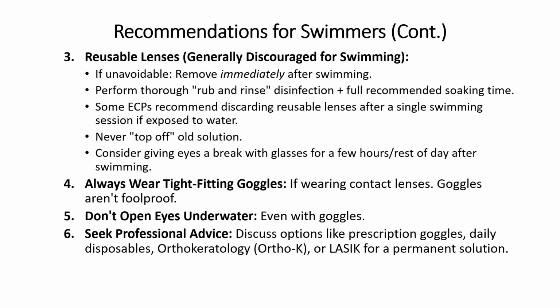Some eye care professionals might even recommend discarding reusable lenses after a single swimming session if they were exposed to water, regardless of their scheduled replacement. Always use fresh solution, never top off. Also, consider giving your eyes a break by wearing glasses for a few hours or the rest of the day after swimming, especially with reusable lenses.